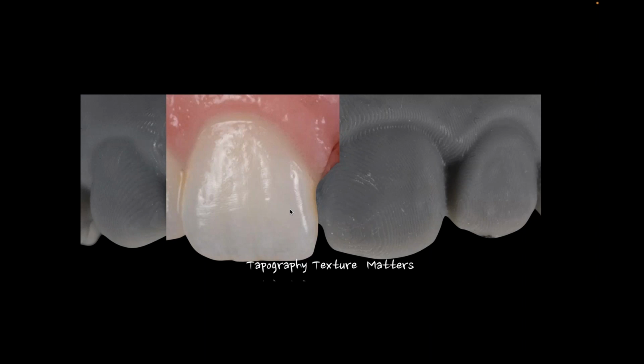But I've said in previous webinars, and I'll say it again, we don't accept veneer cases on printed models, and some full arch implant cases we're pretty skeptical on. So we try to avoid some of those things for some of the printed casts, only because of the inaccuracies in the print and the details that we lose for that. And single centrals was the third that I left out. So why would I not take it on a single central?